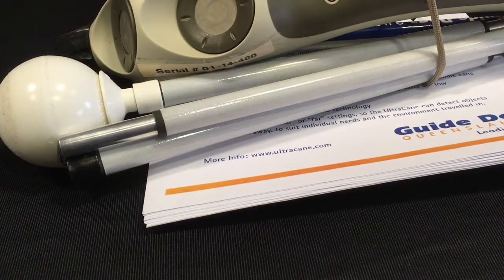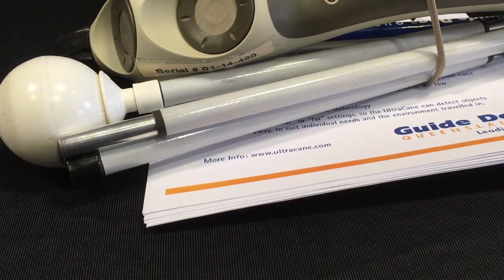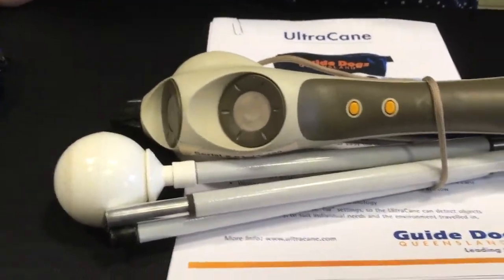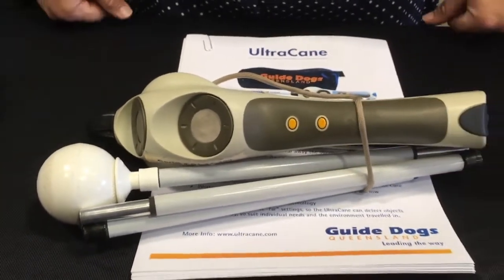Hello again internet, this is CatTiger here again and we are at the Guide Dogs table at the Guide Dogs and Mobility Expo. I'm here with Vicki from Guide Dogs Queensland and we're going to take a look at the Ultra Cane.